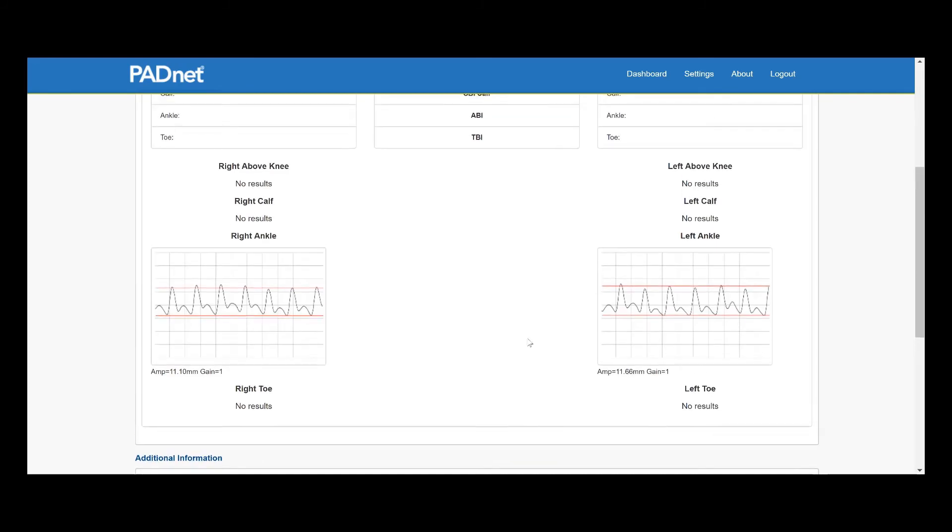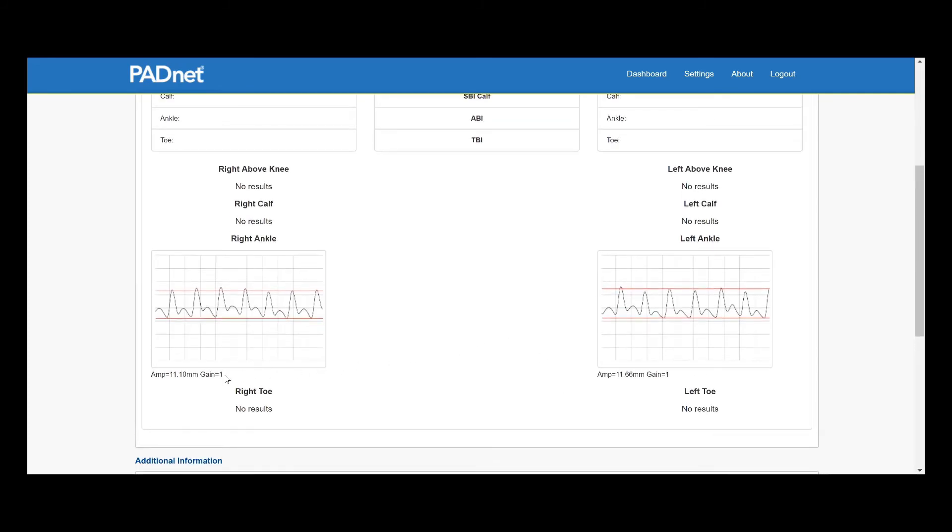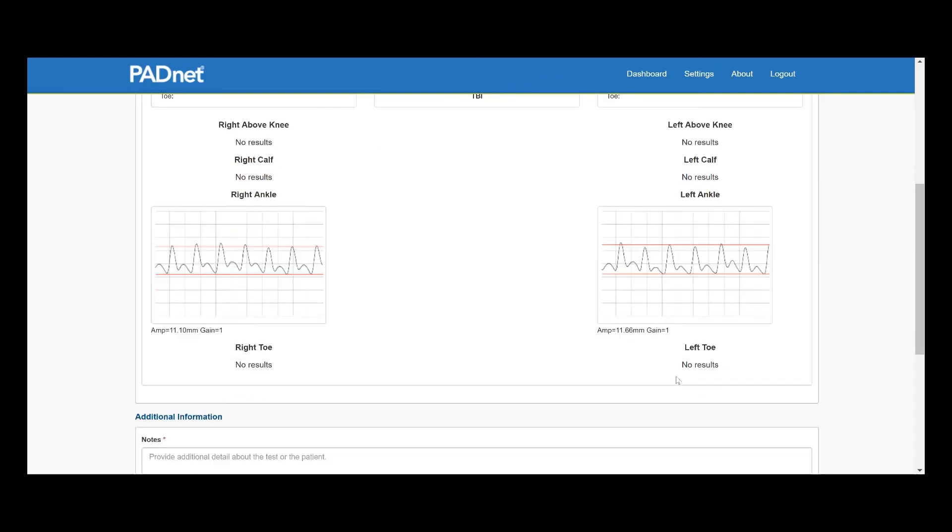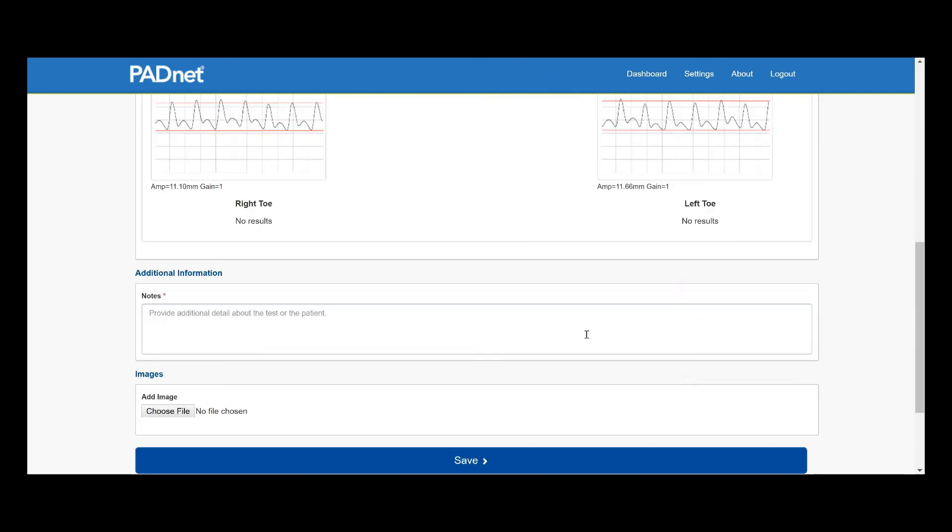Once we're done, we click Next. We make sure that all of our test segments are accurate, we check our gains to make sure they're the same, and we check to make sure that we can see the entirety of our wave graph.